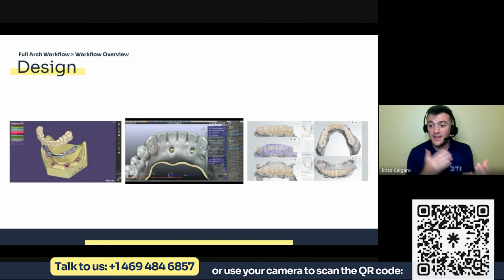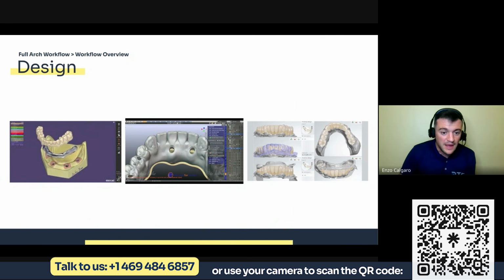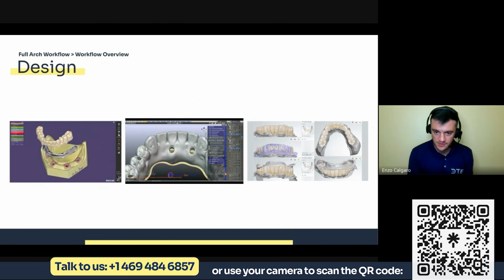You have Exocad. Amann Girrbach has its own Exocad version, which is called Mind. They're the same base. So anyone that knows how to handle Exocad is going to know how to handle Mind. It's that easy. Then on the other end here, you have 3Shape. It's probably the 2nd most common design software out there.